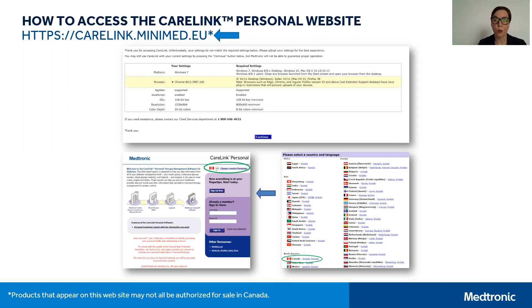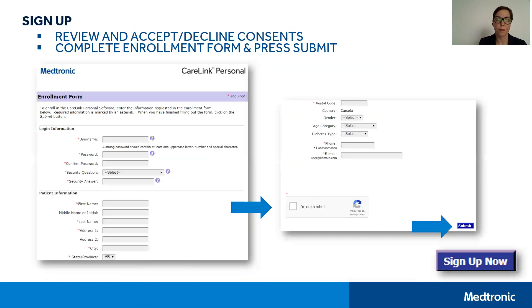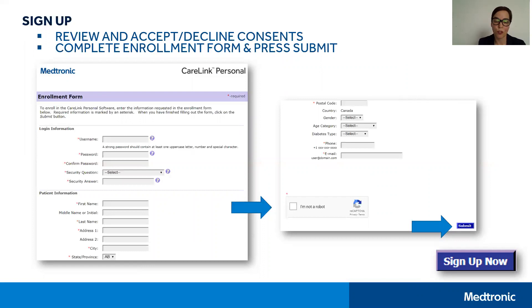After that, you'll want to complete the sign-up process if this is your first time using the software — click on Sign Up Now. This will take you to the enrollment page, where you will review and accept or decline several consents regarding use of CareLink Personal software as well as your privacy and your data. You'll then complete the enrollment form and create a username and password. It is highly recommended that you write down your password and username in case you need them in future. Once completed, click Submit.